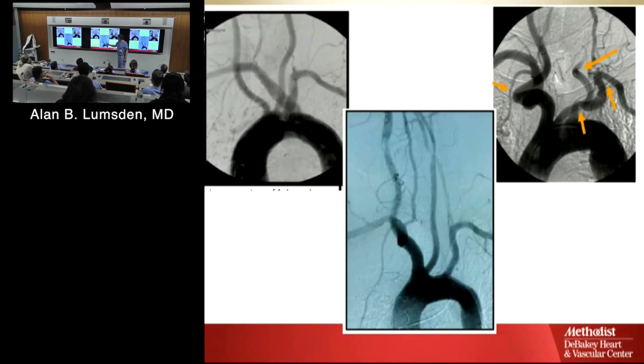Why does that look so different from this? They're old. Okay, this is what old blood vessels sometimes look like. Sometimes they're just severely hypertensive and they get all kind of loopy like this. And so you've got to trace it out. Left subclavian, left carotid. Is it occluded?